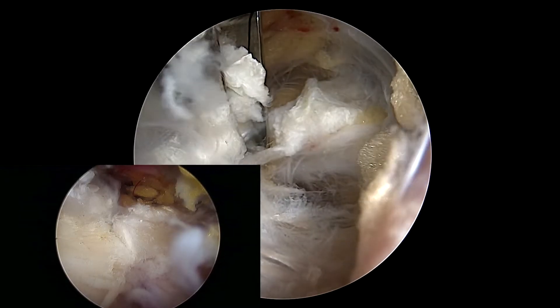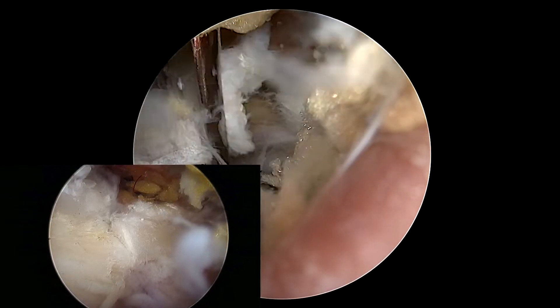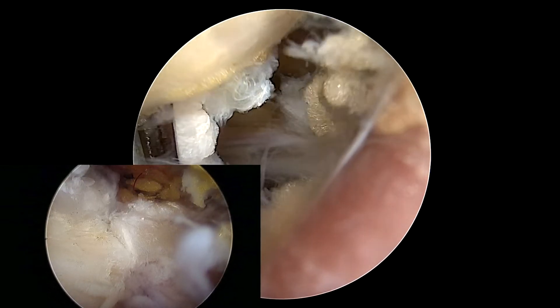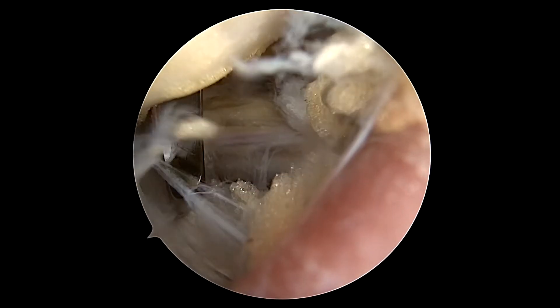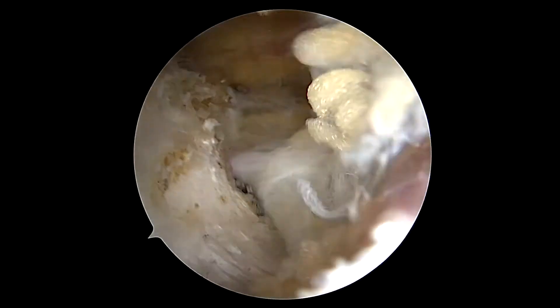In other cases, the ligament had actually ossified, and occasionally it's necessary to use an osteotome — essentially a chisel — to get through that bone. However, that was unnecessary in this case.